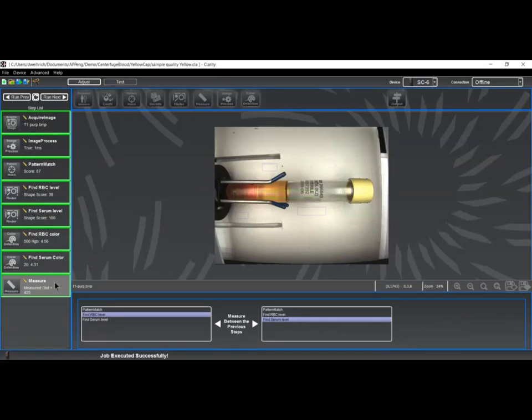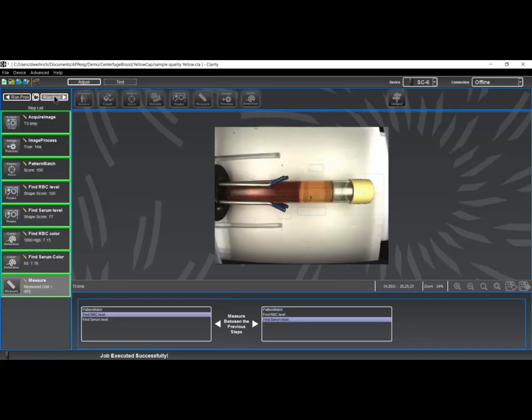I've now added a simple measurement step that basically gives me the distance in pixels between two of the features that have been previously found in the pattern match processing. In this case, I'm giving you the distance between the liquid level found at the edge of the red blood cells to serum transition, and the transition that goes from serum to empty vial at the top of the serum level. Again, for each of these different samples, I'm getting a different distance number. This will be used as part of the validation of the sample because the distance of the serum has to be a minimum amount in order to be able to pull serum sample out of the test tube with a syringe or a pipette.